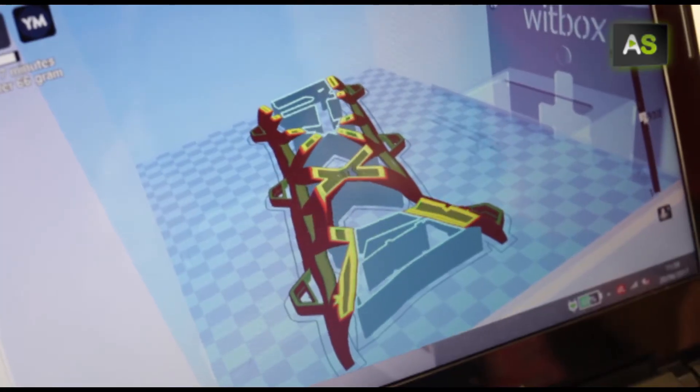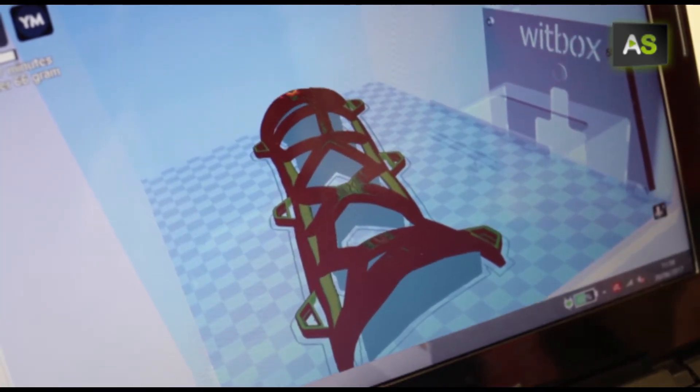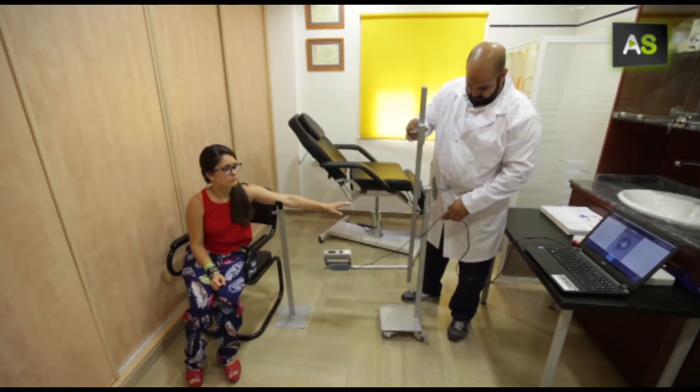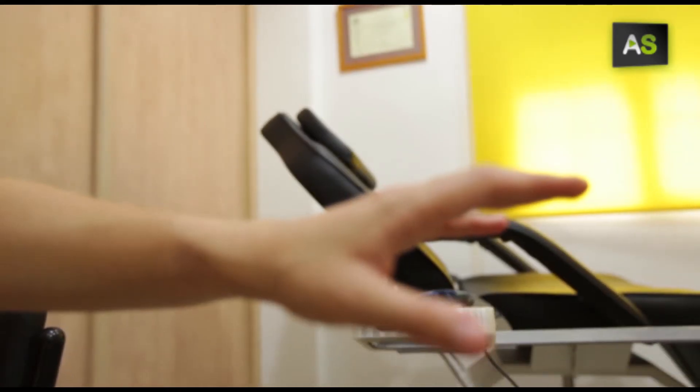The design of each splint can be personalised to each patient and adapted to any condition. It starts with the process of scanning the area where the splint will be attached.